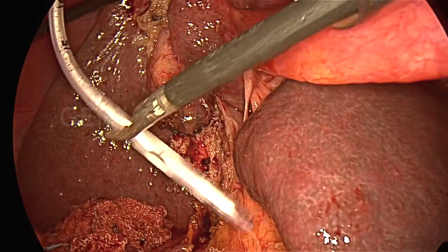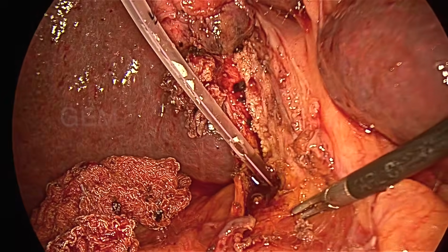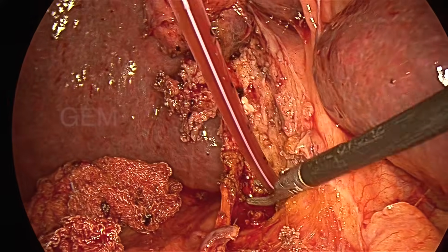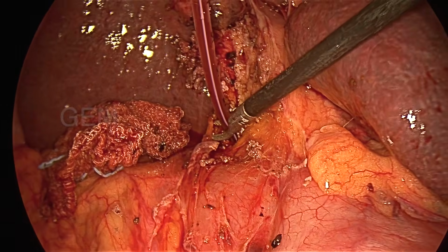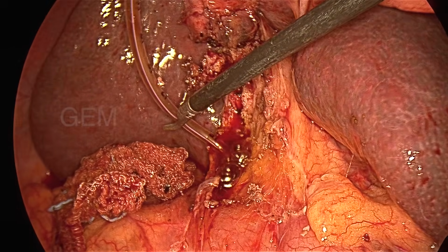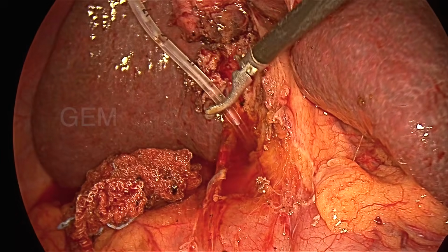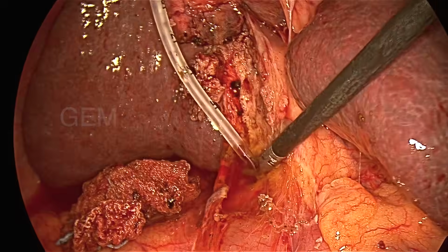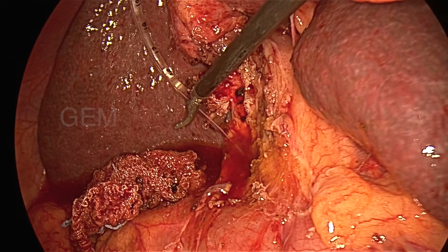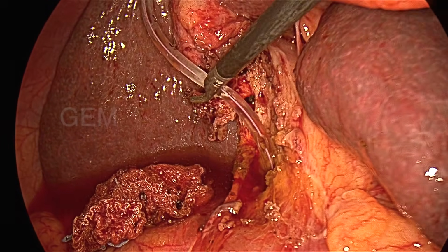and I am taking the suction catheter, might be 10 size or 12 size. I am introducing it inside, and then I am giving a wash. Maybe any small debris or small stone bit will come out. It will go very easily, and they are injecting saline from outside. So it is very free flow. It is going easily, the saline flow is also pushing easily, and I can move this instrument well. That means it is going slowly into the CBD. See now the small stone is coming out.